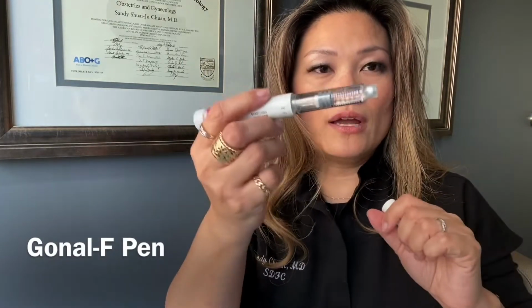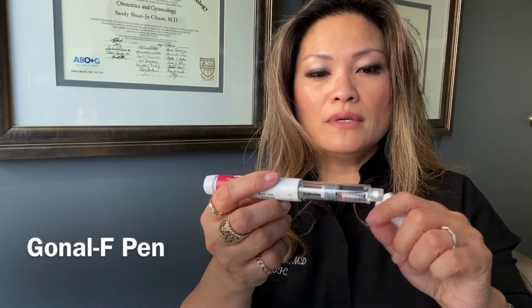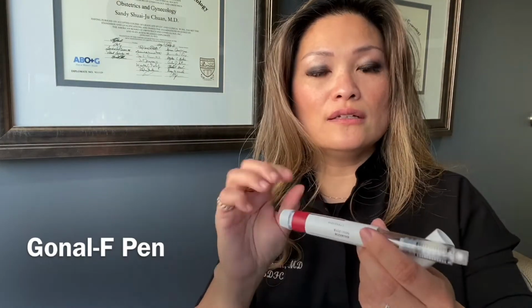However, I want you to know that Gonal-F also comes in a pen form, and this pen form is about 900 units in there, and it comes in already pre-mixed liquid form, and you'll have to attach a needle and adjust the dose.